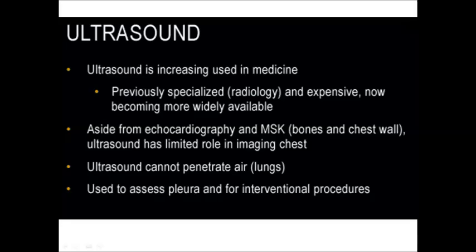Ultrasound is increasingly used in medicine in recent decades. Previously specialized and expensive, it is now becoming more and more widely available.